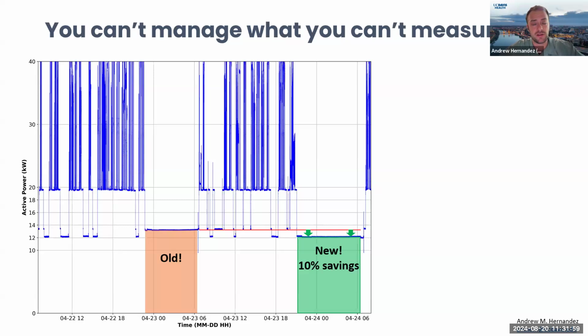And so what our technologists did is, after the last patient scanned for the day, they would restart the system. For reasons I'm not going to get into, we didn't fully shut these systems down. But what we found is that if the technologist did not wait 15 minutes before restarting the system, the timer that says put the system into low power mode would completely turn off. So they would reboot the system before that 15 minutes after the end exam, and the system would never go into low power mode. This was really an easy fix for us. We told the technologists to, instead of restarting the system in the evening after the last patient, do it in the morning. And we found that this resulted in significant savings. Next slide.